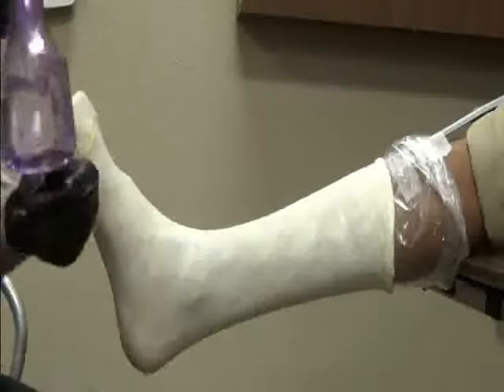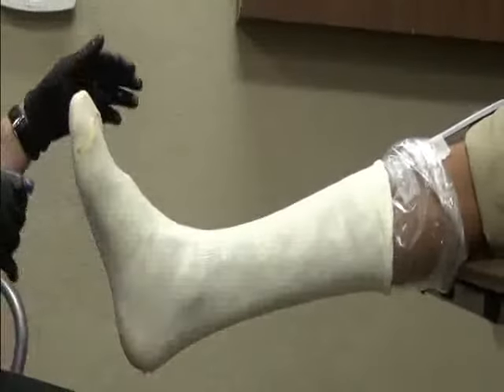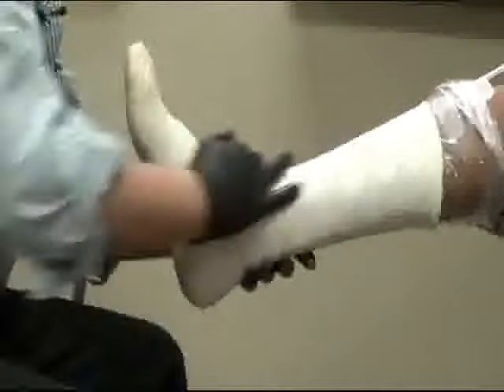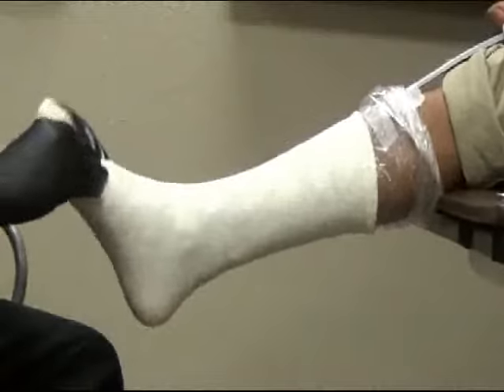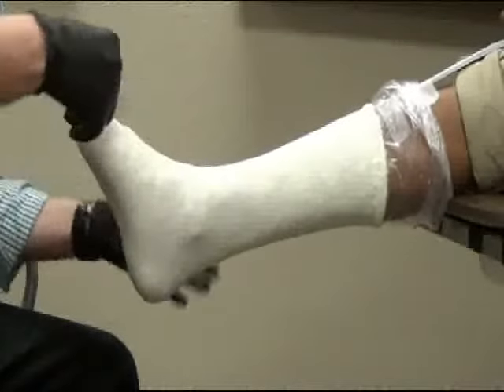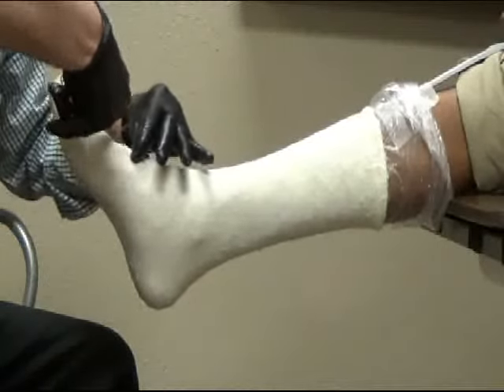Have the patient hold their foot at right angles. Spray the sock with water and massage for close contact of the sock against the skin, eliminating all wrinkles. Once the sock is completely positioned, make a small incision in the sock with the scissors at the distal aspect of the toe. This incision has to be no more than one centimeter big.